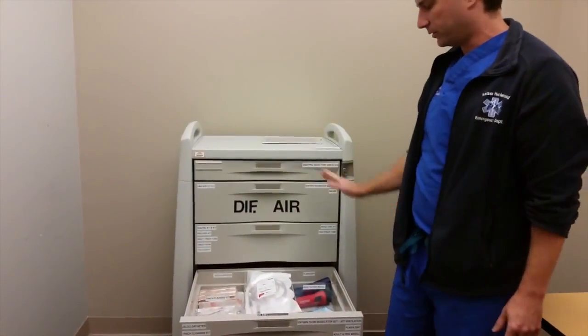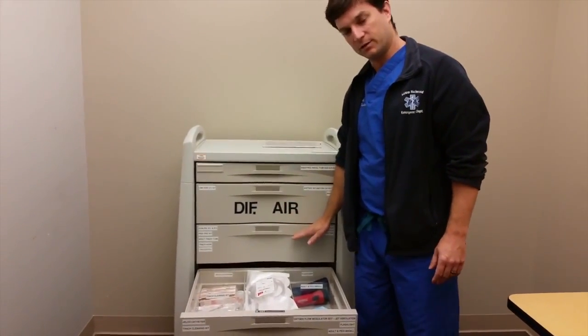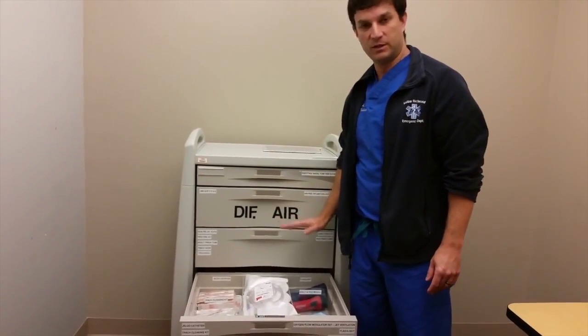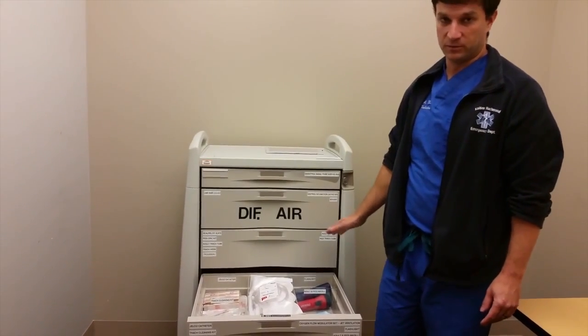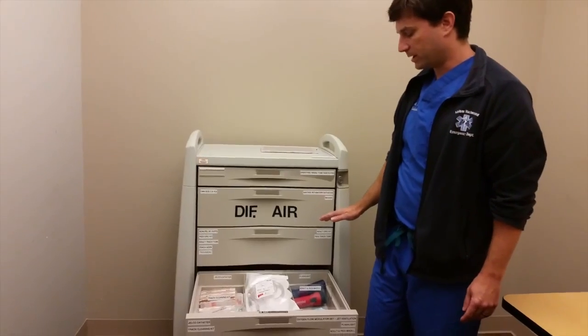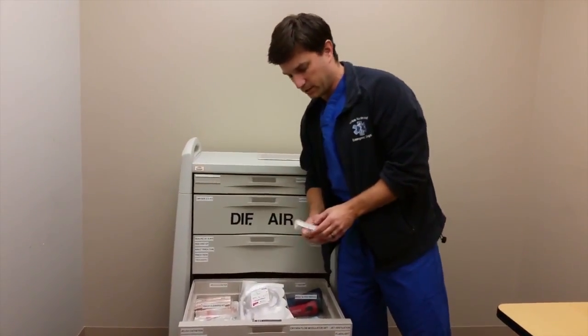Next drawer down, I put in here for kind of, you still need a surgical airway, but you can't use any of these things, either because there's altered neck anatomy, you can't cut in there, they have a big goiter, or they're a small kid. So something is precluding the use of a cricothyrotomy approach and making a big incision, and you're nervous about it. The other option would be to do a transtracheal jet airway.